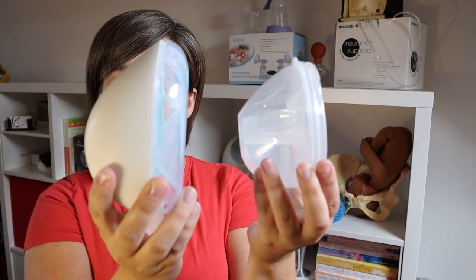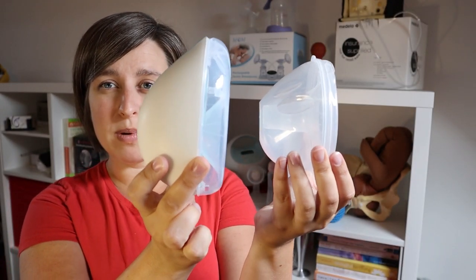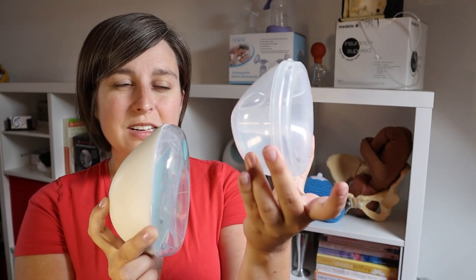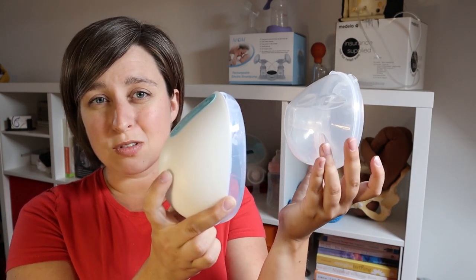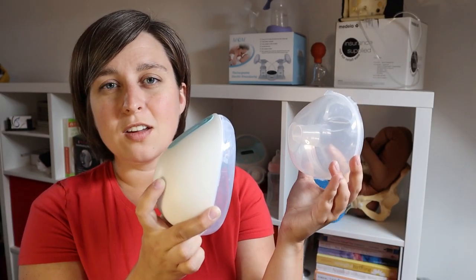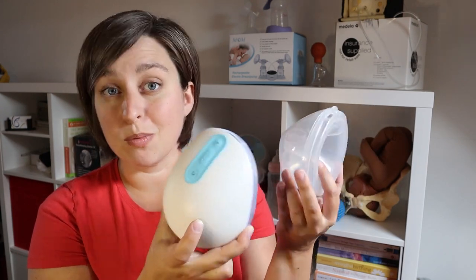Let's look at the size. Here are the two pumps side by side. You can see that the Willow is a little bit bigger but that's because it has the entire motor inside it. The Free Me is still a little bit bulky, and both of these are going to be noticeable under your shirt. Just try to accommodate for that — wear a scarf or just be okay that you're pumping. There's no way you're going to have normal looking breasts while pumping with any pump.